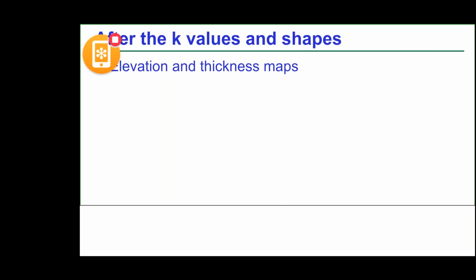You know, thin corneas are scary. Everybody knows that, right? And thick corneas, you're all happy with thick corneas, but not necessarily that a thick cornea is strong, and not necessarily that a thin cornea is weak. Let me give an example again. Bruce Lee, he was very, very thin, but he was very strong. But you can have a fat diabetic person who is very weak also.